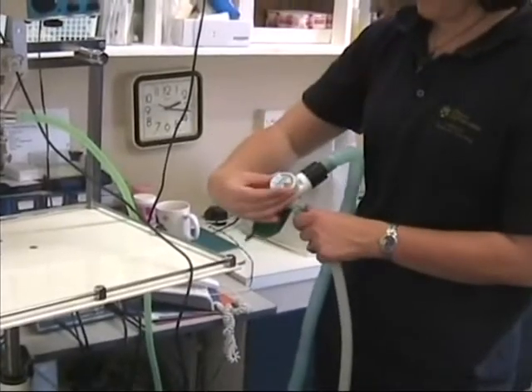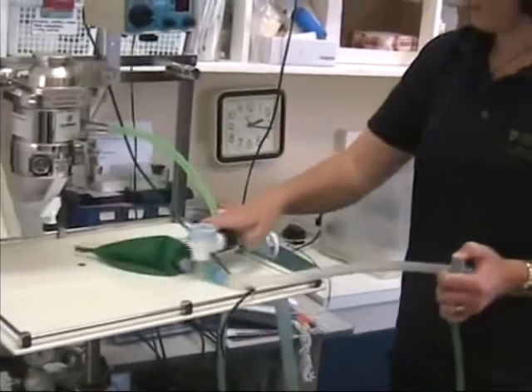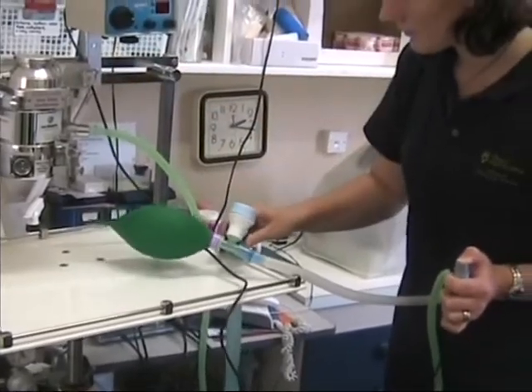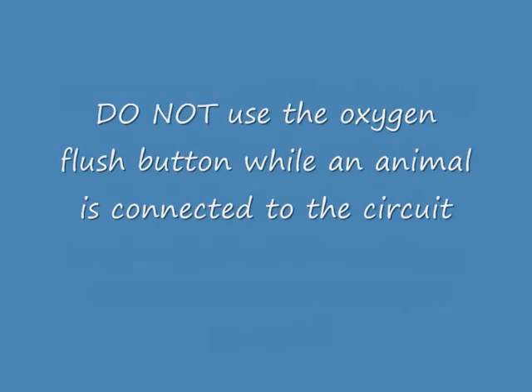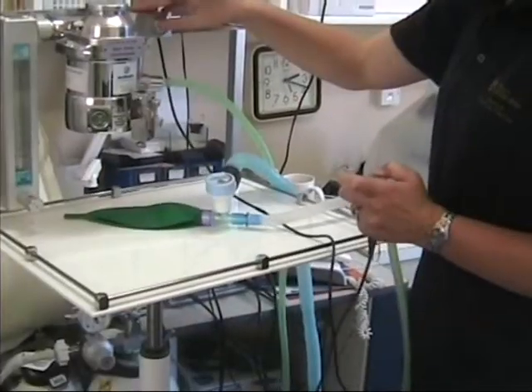A low pressure check of the circuit is then performed to check for any leaks. Close the pop-off valve, occlude the patient end of the circuit and fill the re-breathing bag. Watch the bag carefully for about 20 seconds to ensure that the bag does not deflate, i.e. there are no leaks.